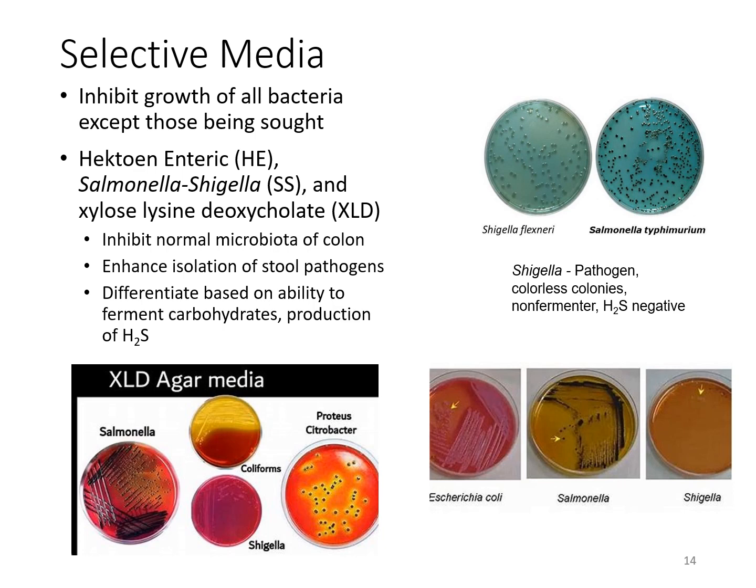So with your HE agar, that's like a greenish type of color or pigment to that agar. And then based off of those colony characteristics, in this particular example here, the pathogen is your colorless colony here for the Shigella. You can see where the Salmonella species did that darkening, and that would mean that it is H2S positive, where the Shigella is H2S negative.